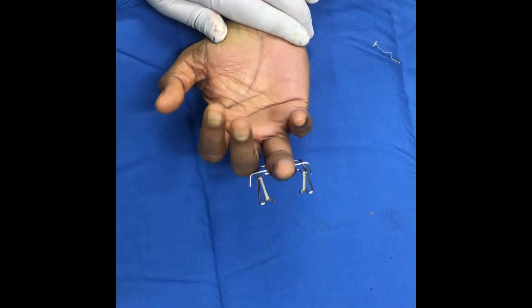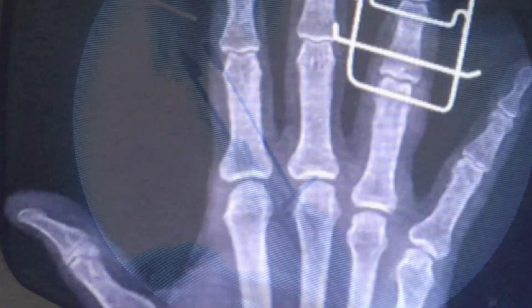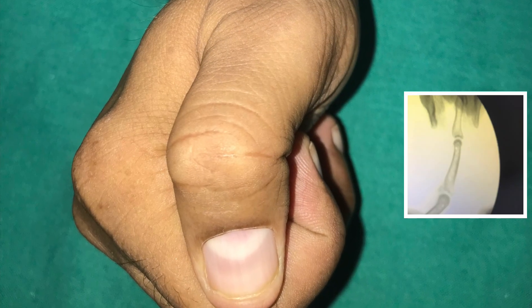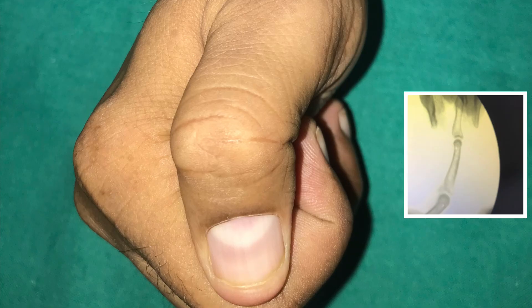Since this operation is done under local anesthesia, the patient can move his finger immediately after surgery, as you can see that the reduction is well maintained. After three months, range of movement is very good and the joint is healed. Thank you for your patient hearing.